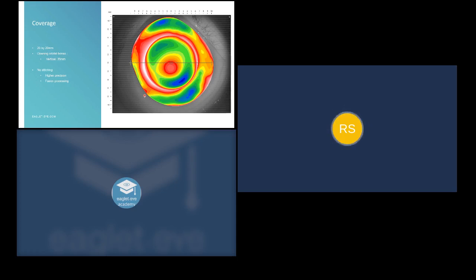We believe that if you ask a patient to look up or look down, you are changing the shape of the conjunctiva. The conjunctiva is really fluffy, so in some patients it's really going everywhere. And stitching that together, looking up, looking straight forward, looking down, means that you have to smooth a lot. So you're losing a lot of information. Therefore, we always take a shot just looking straight forward.